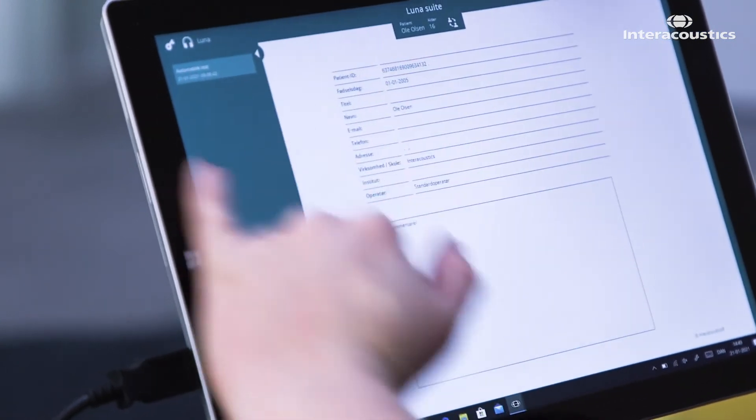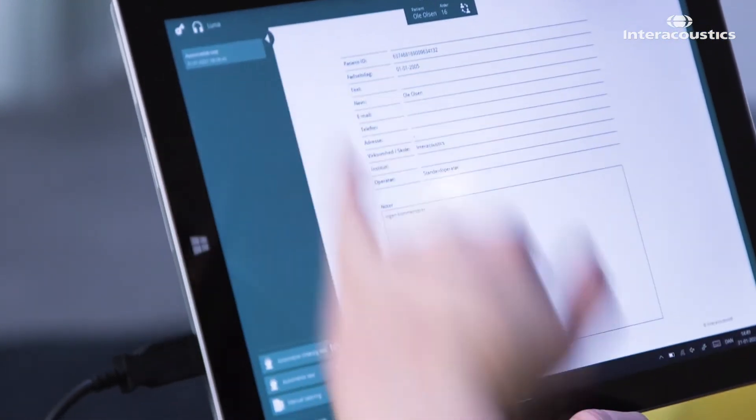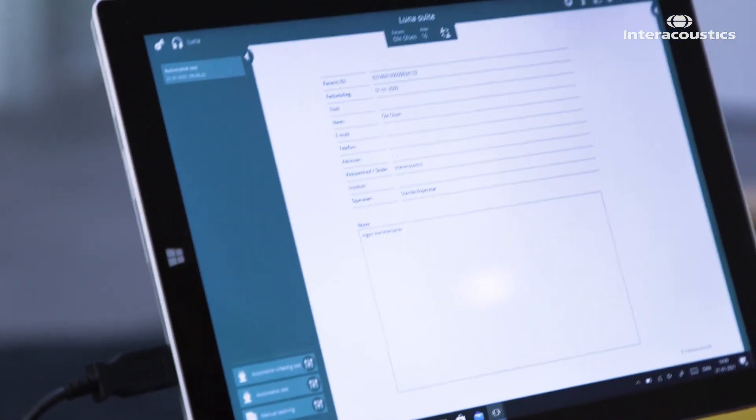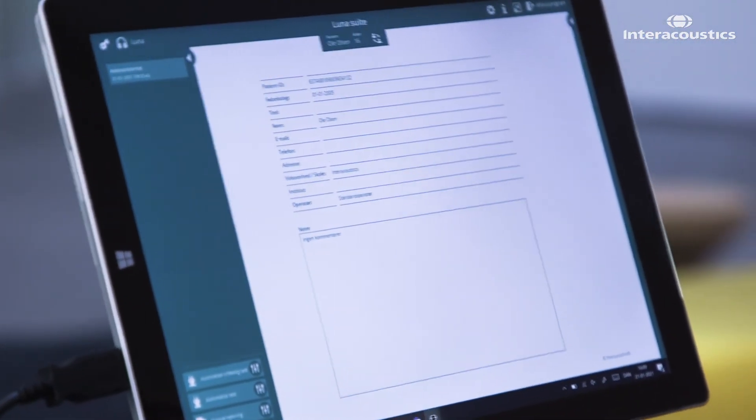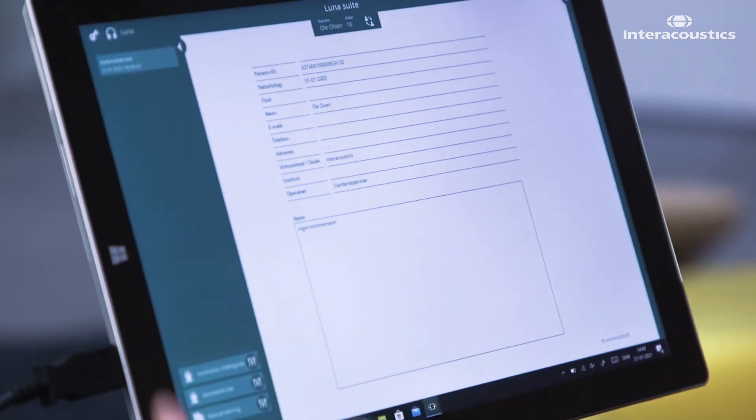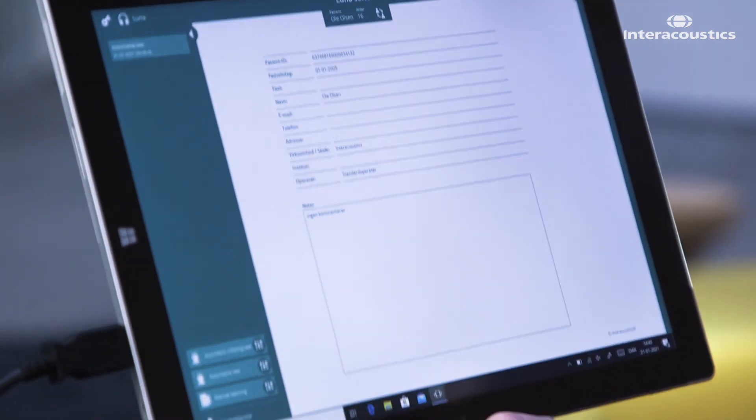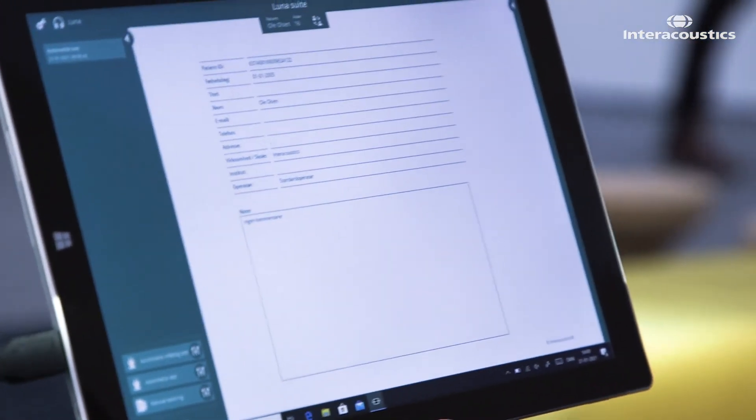Up in the upper corner you have the list of tests that has been conducted on the patient. And at the lower corner you have the tests that you want to run.